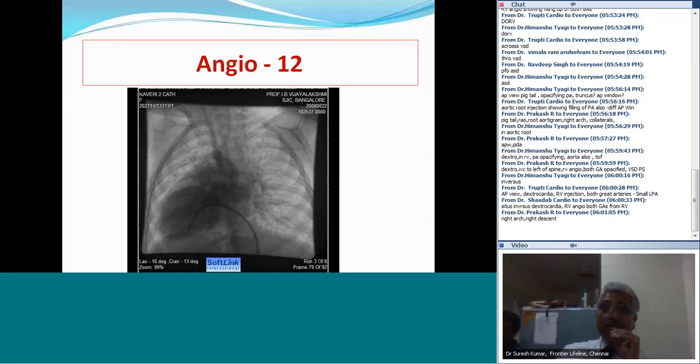Can you see this? Naldeep, can you see my marker? Himanshu also, can you see where the marker is? Classic or otherwise, it would be a difficult thing. Prakash has got it. It's a BT shunt only. It's a right arch. It's a BT shunt performed from the left side. So it's a left sided BT shunt.